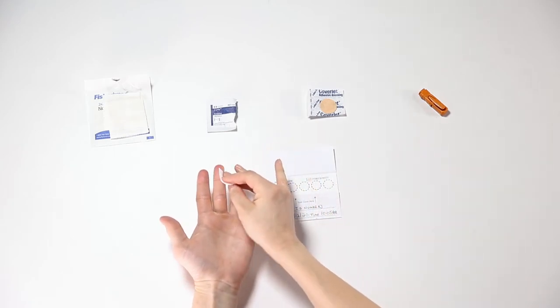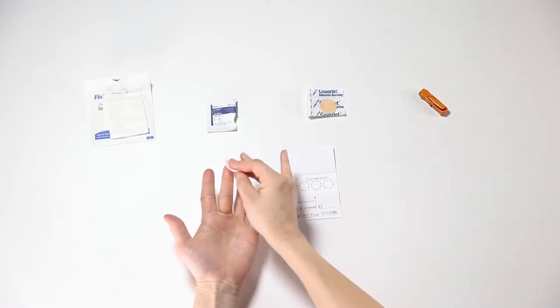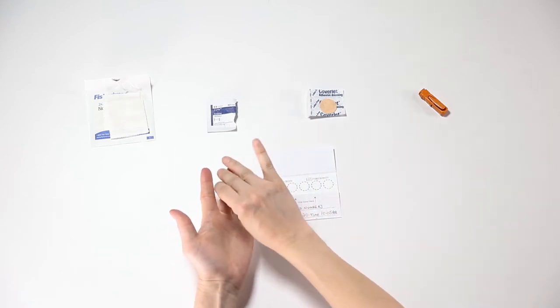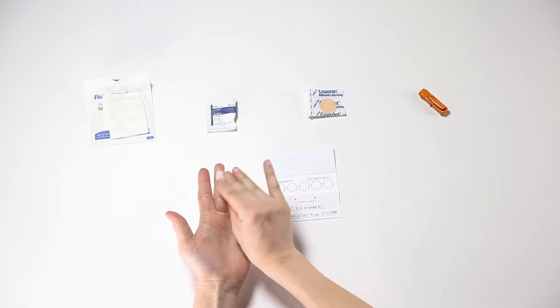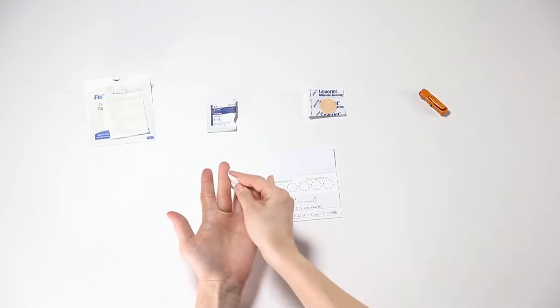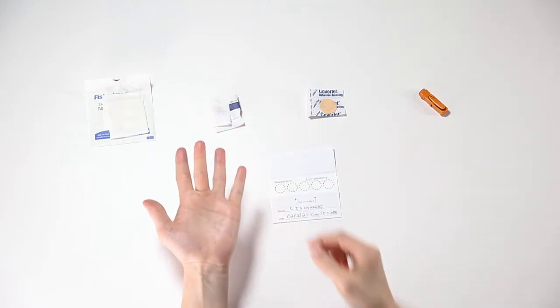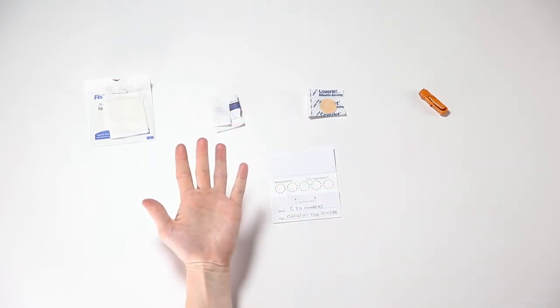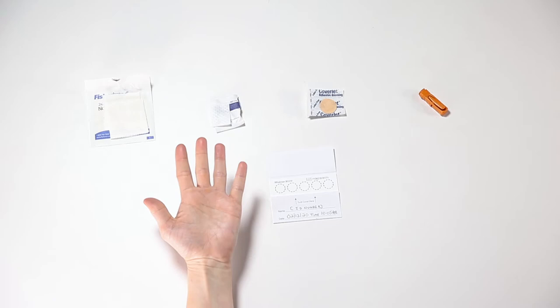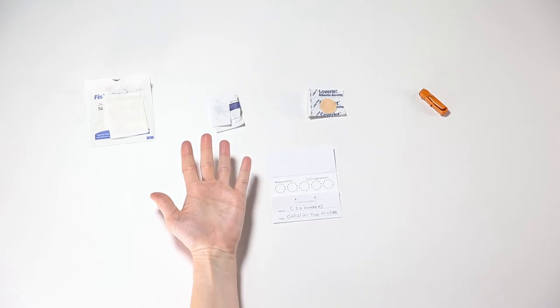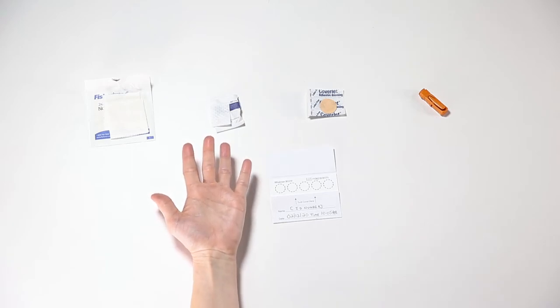Using the alcohol wipe, gently clean the tip of the finger that you intend to stick. Let the alcohol dry for 10 to 15 seconds. It is best to use a middle or ring finger that does not have any rings on it to collect the blood spots.